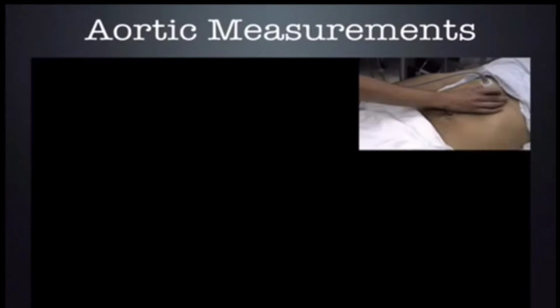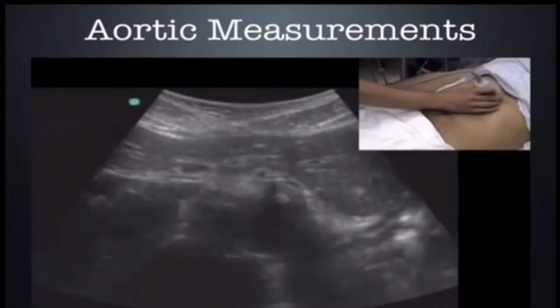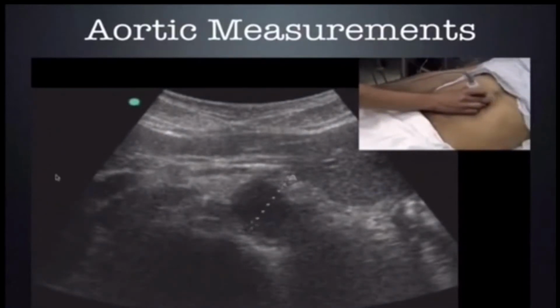Here's an example of how to make your formal measurements of the aorta, largely for documentation purposes. Again, you're going to start with the probe in a transverse plane in the epigastrium, with the probe indicator pointing to the patient's right. You start off by identifying the anterior cortex of the vertebral body, and you will then notice an anechoic structure just to the patient's left of the midline. This is the aorta. Once you've identified this, you'll place your measurement.